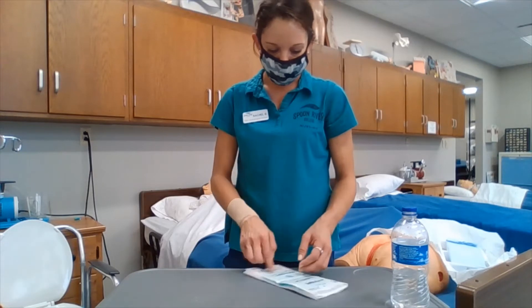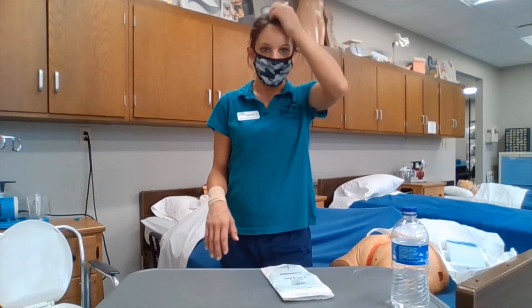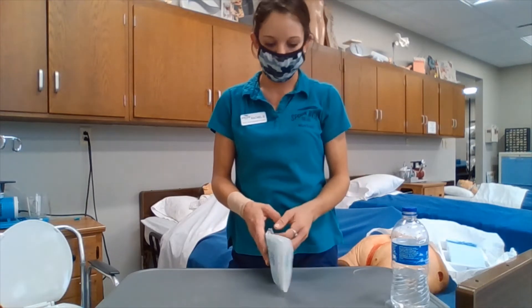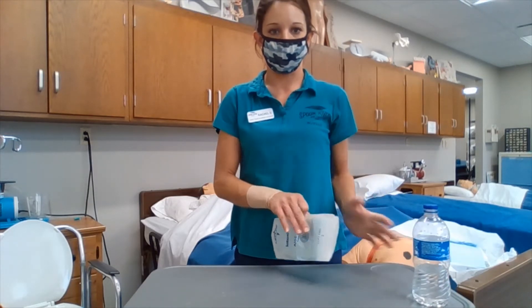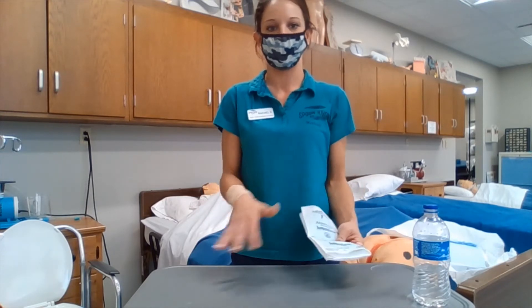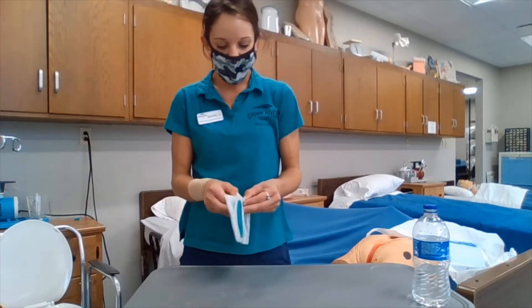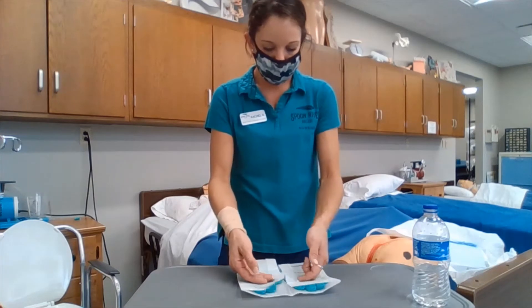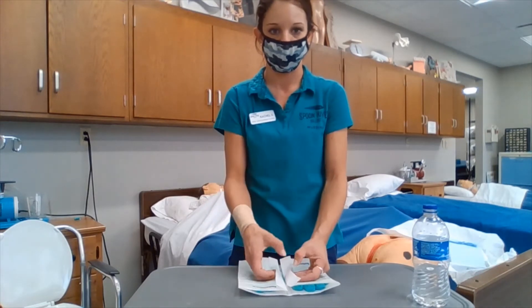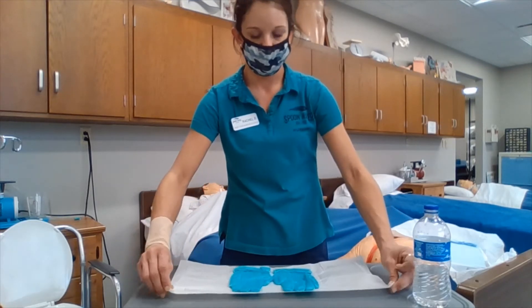In donning gloves, if we are opening our gloves in the previously opened sterile field that we have, we want to make sure that we are not crossing them over or touching them. We are opening them up by the flaps, making sure that we are not contaminating the inside. We are going to open and straighten them out without touching the inside.